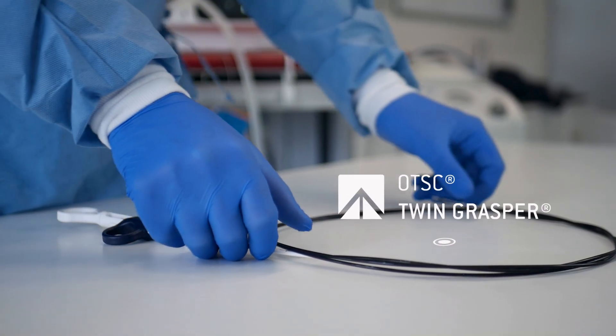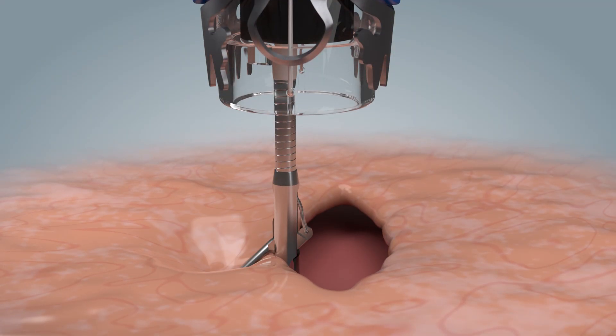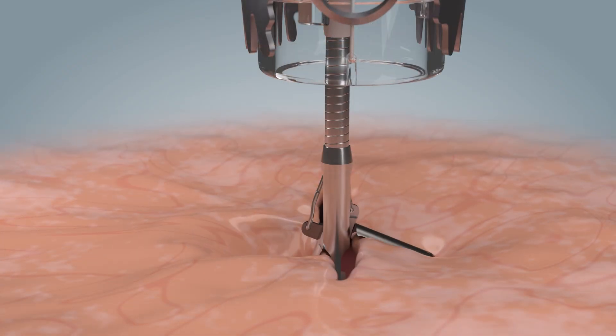The OTSC twin grasper, with its two separately controllable jaws, supports controlled closure of lesions, enabling closure from serosa to serosa.